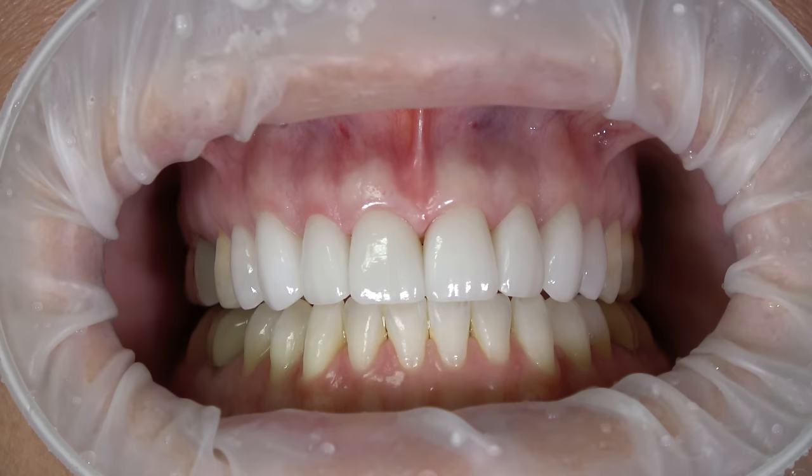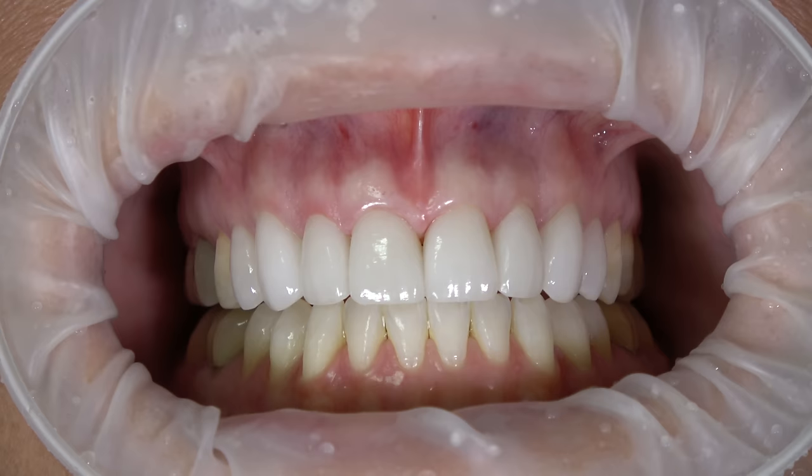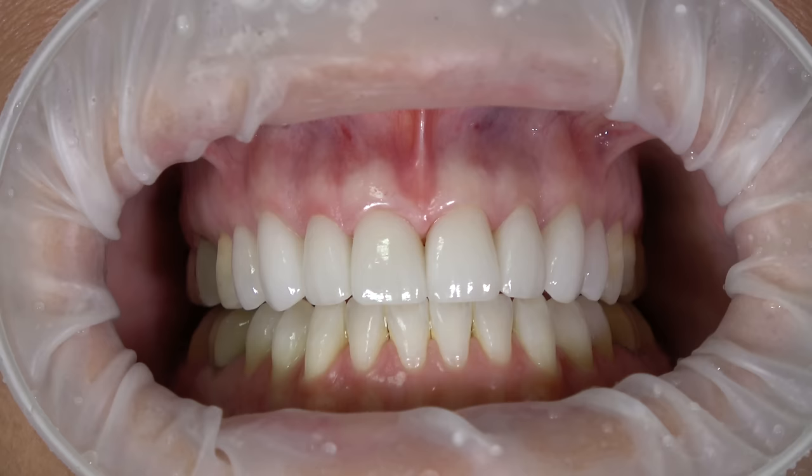We're going to go ahead and use the diode in the cutting mode, somewhere around 1.2 watts. This is touch screen, so we can either raise or lower the wattage depending on how the cut is being made.